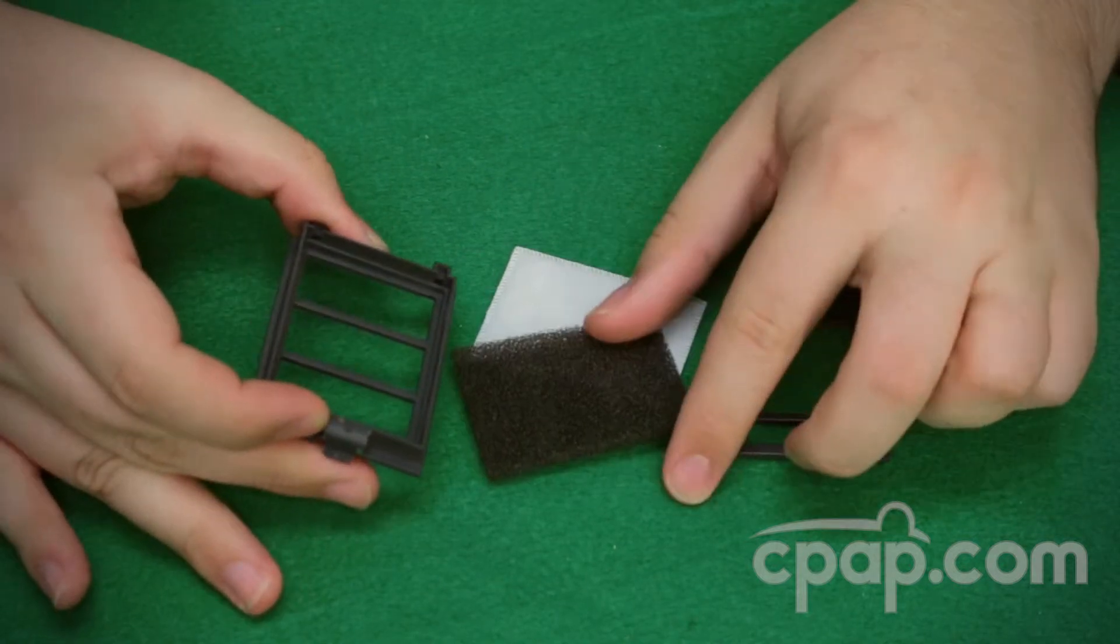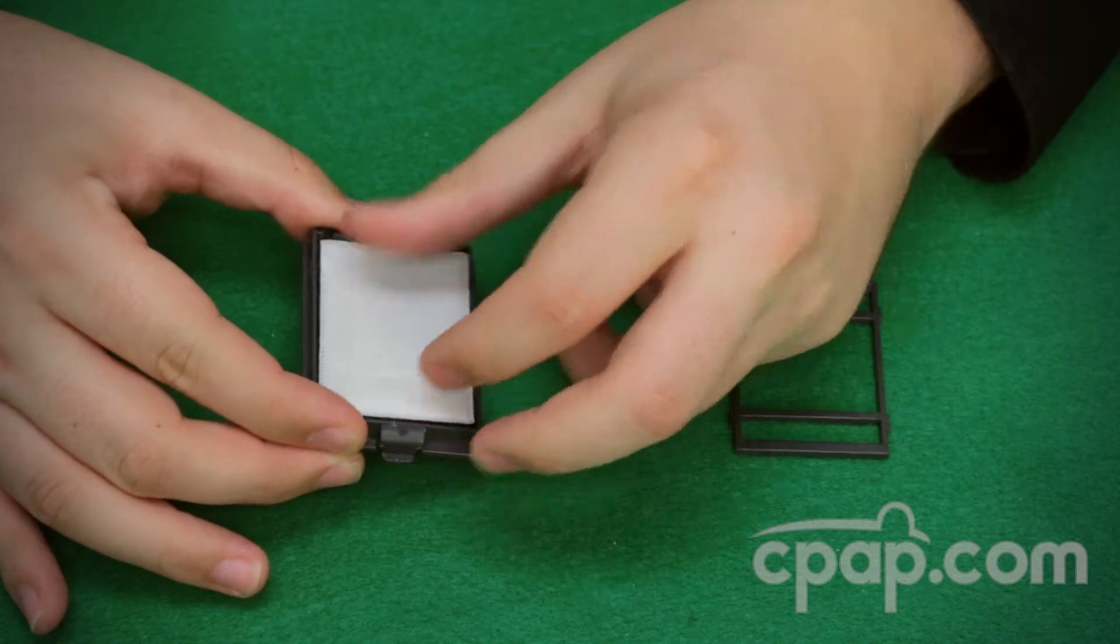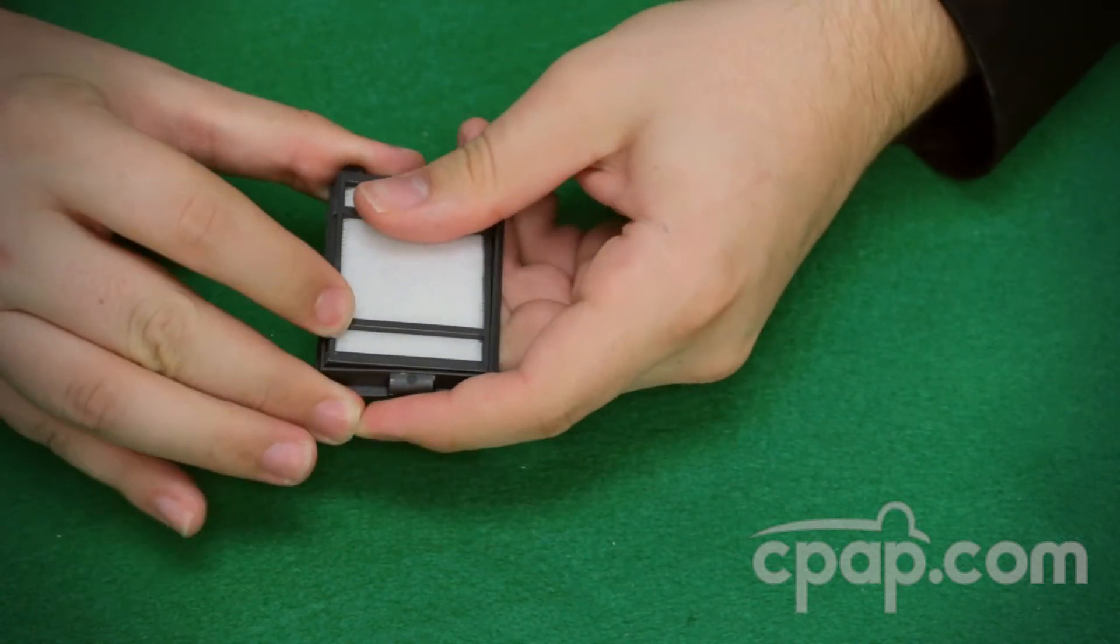To reassemble, place the black foam filter into the cassette frame, place the white filter on top, then snap the cassette back into place.